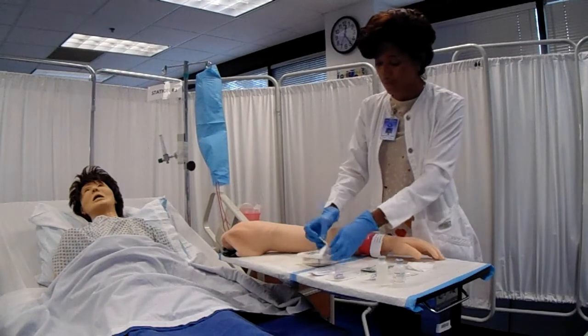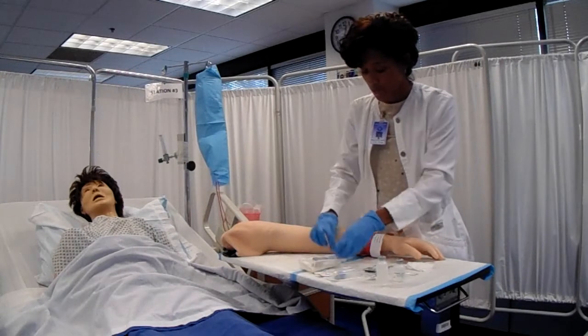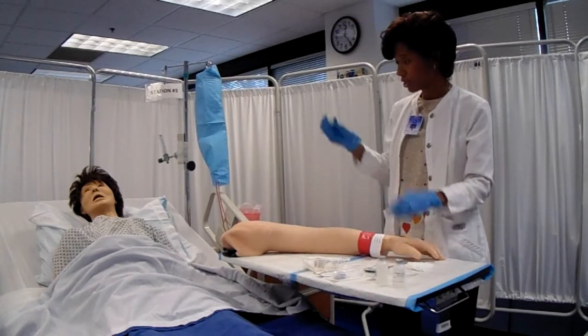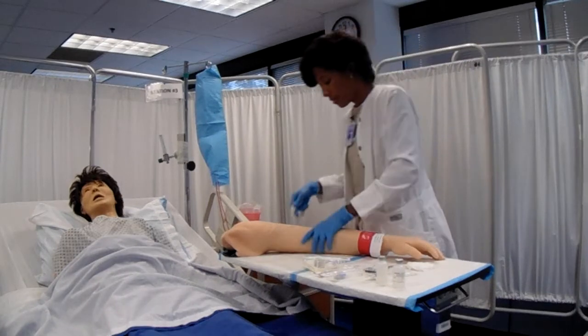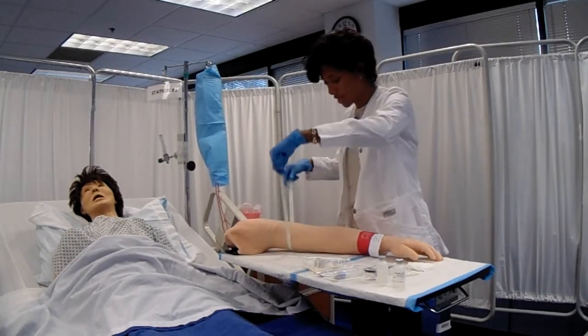I'm going to open my IV kit. And I'll be putting an elastic band around your arm. It's called a tourniquet. This just helps with venous engorgement so I can visualize those veins.